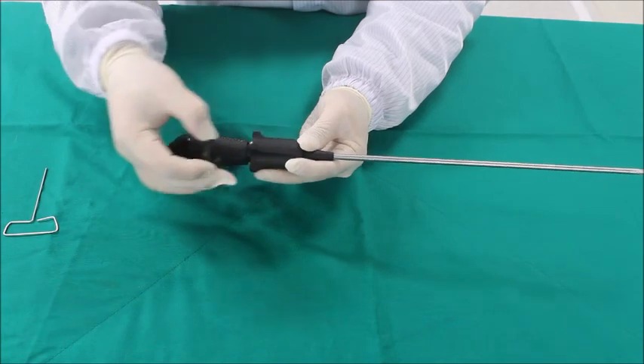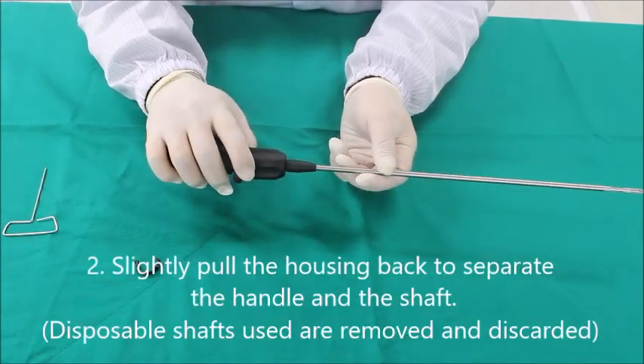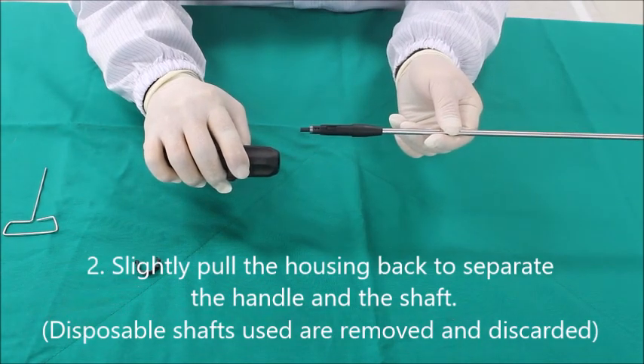Remove the safety ring before separating the handle and shaft. After removing the safety ring, slightly pull the housing on the handle to separate the shaft and handle.